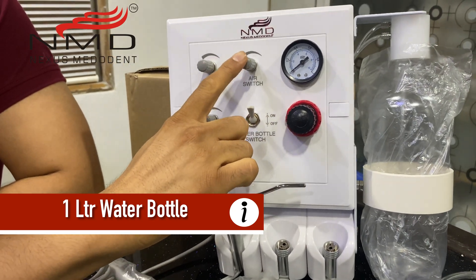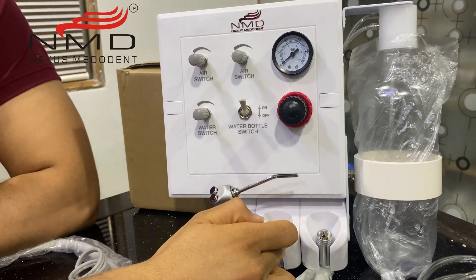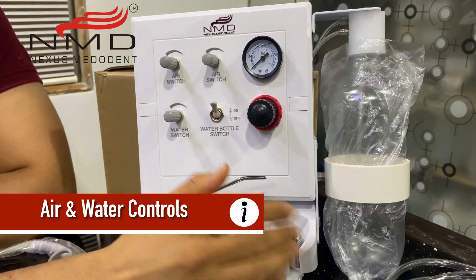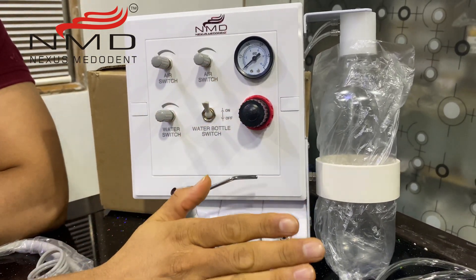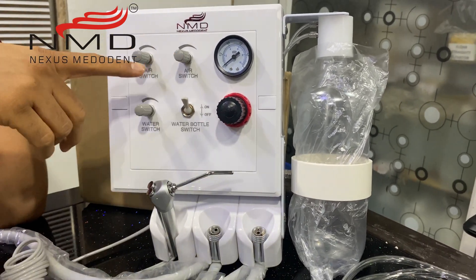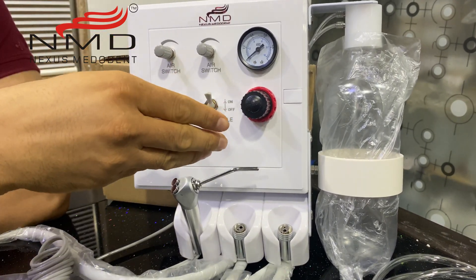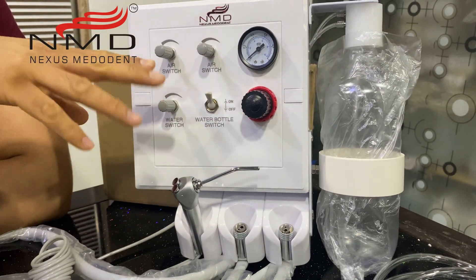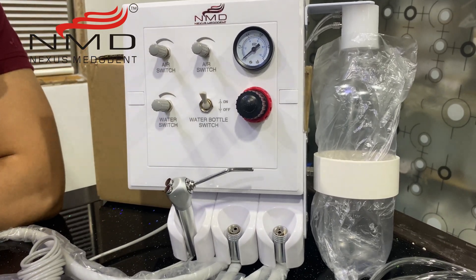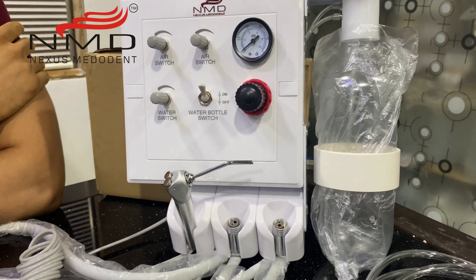Coming to these points: this connection is the air connection for the first point, this is the air connection for the second point. This is the bottle switch — if you don't want water, you switch it off and there is no water. You can do any work that does not require internal water, as the water will be blocked. And this is the water regulator — if you want to increase or decrease the pressure of water, it can be controlled by this button.